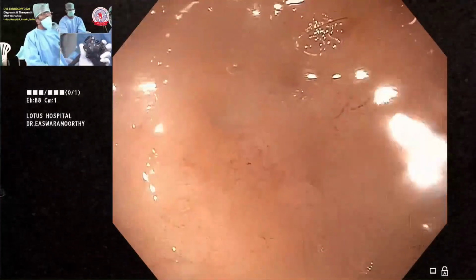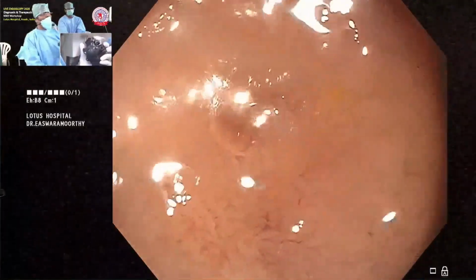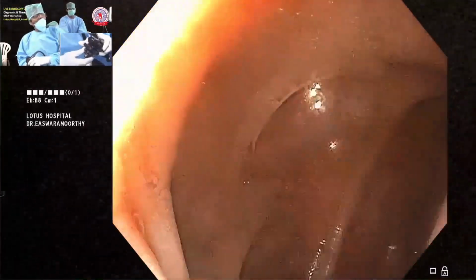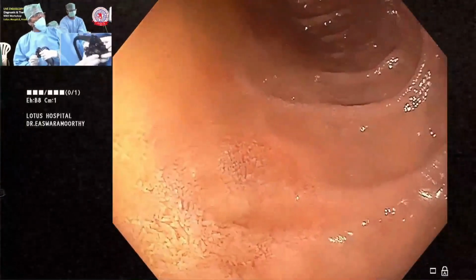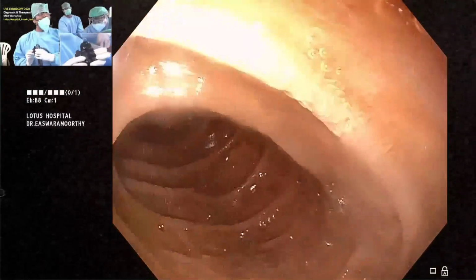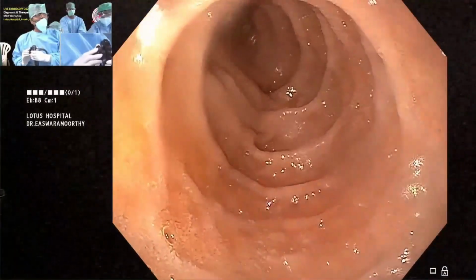You can see here there are some small changes, the scarring, and also duodenal erosions. Then I turn the small wheel away, and then the big wheel like this, then I go further in. There is no obstruction now, as you can see, it is all healed. There is only minimal scarring, you can appreciate. I can go right into the second part. And what I have done just now is shortening the scope.